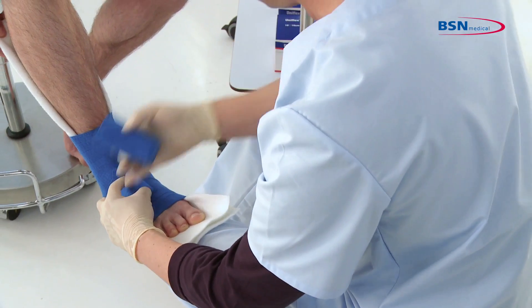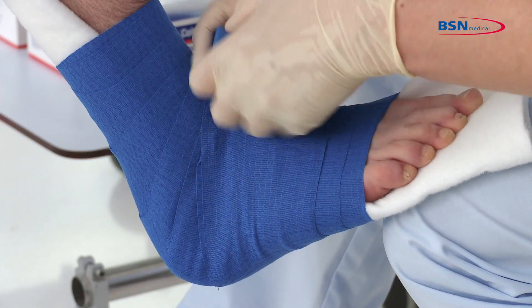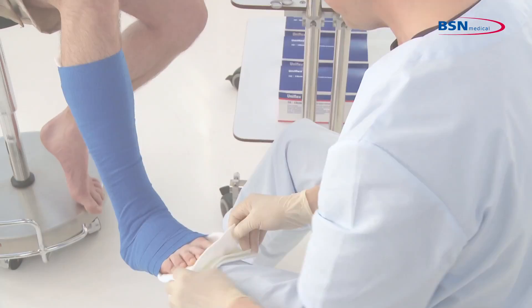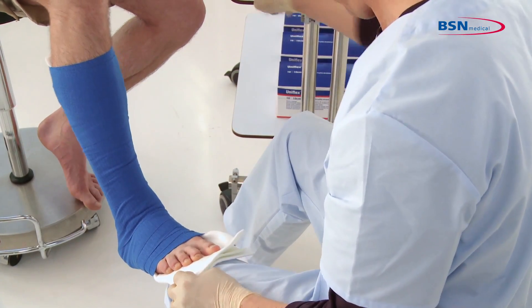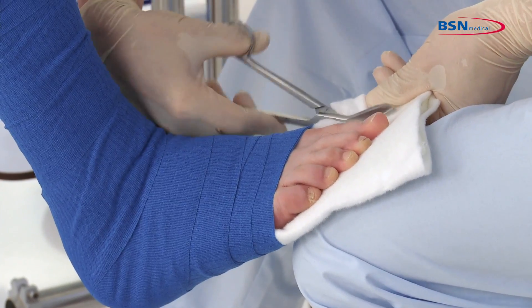Now take a second bandage and wrap up and down the leg to secure the splint. Please be aware to have the end of the second bandage near the ankle again. Trim the splint to the shape of the patient's foot.